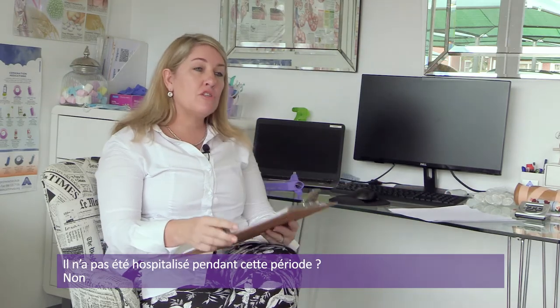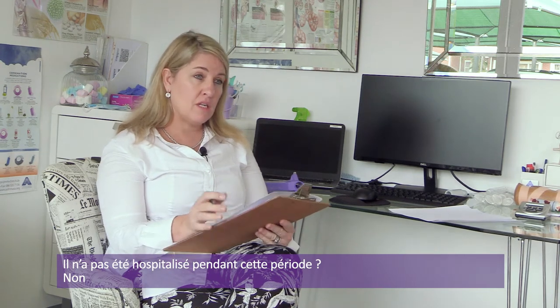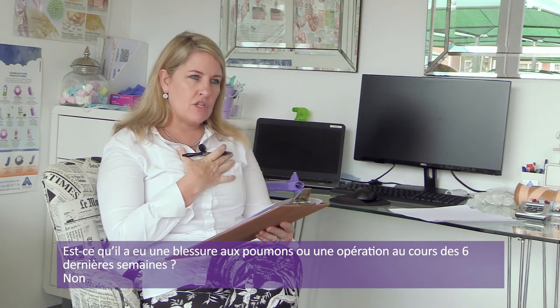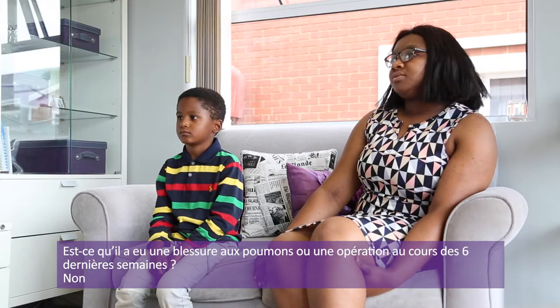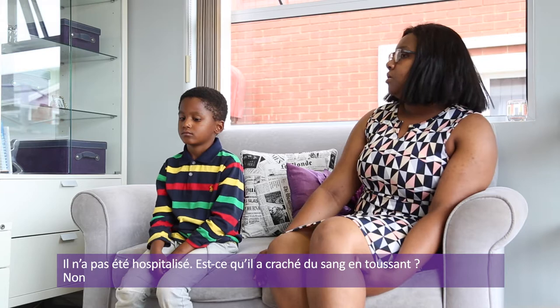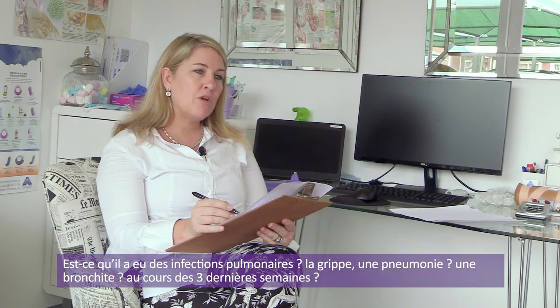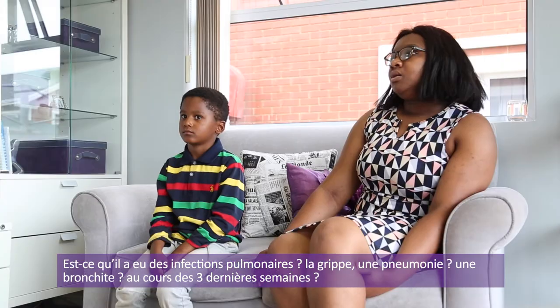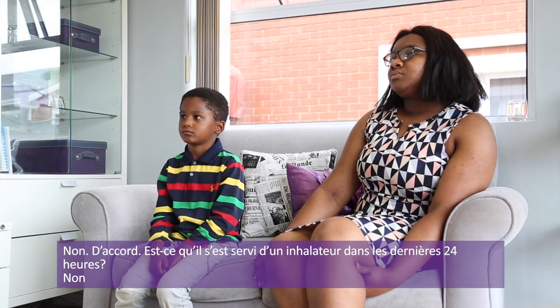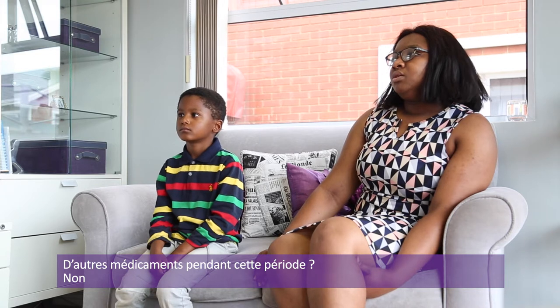So now what we're going to do is just do a questionnaire to make sure that it's safe for him to go onto the machine, okay? So has he had any injury to his chest or any operations in the last 6 weeks? No. No. He hasn't been admitted to hospital. Has he coughed up any blood in the last 6 weeks? No. Has he had any chest infections, flu, pneumonia, bronchitis in the last 3 weeks? No. No? Okay. Has he used an inhaler in the last 24 hours? No. Any other medication in the last 24 hours?